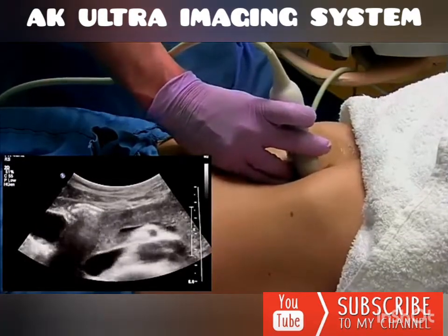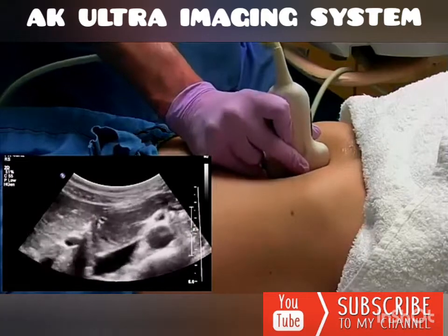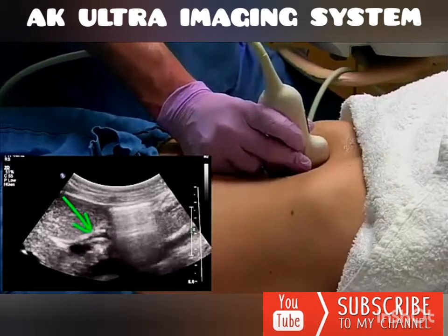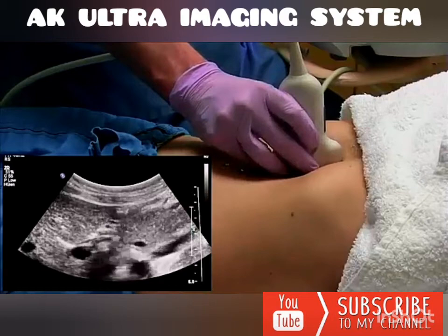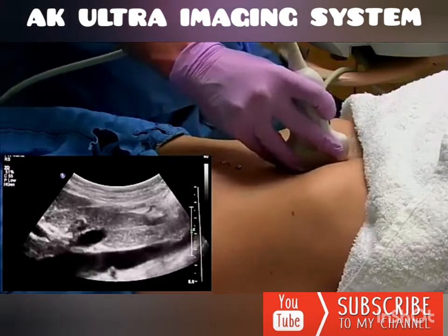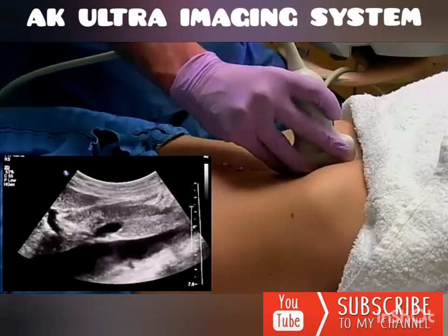All right, and if you find the CBD, you can also turn sagittal to the CBD from this position and elongate it as it goes into the liver. If you do see anything in the pancreas also, you could get transverse images of the pancreas, for which your probe will be in a sagittal plane to the patient's body.